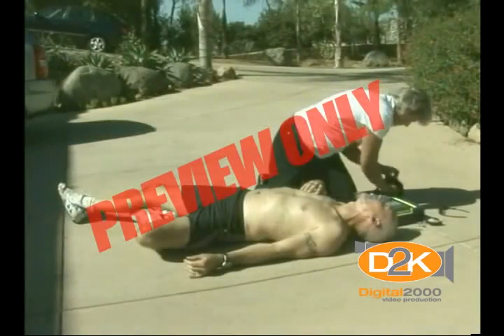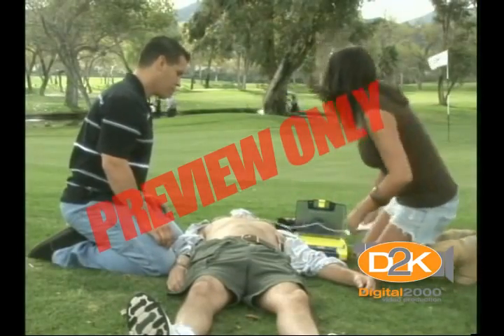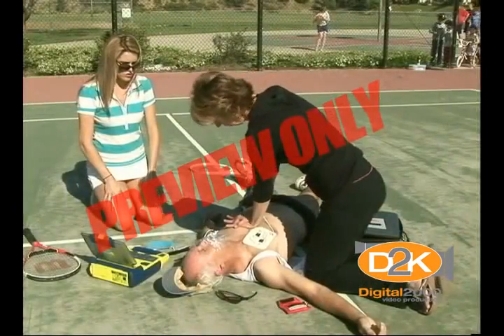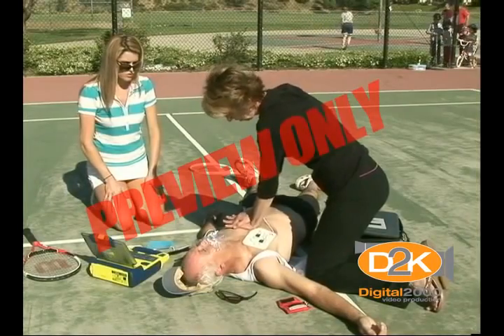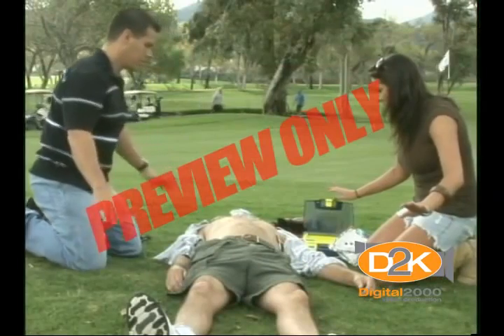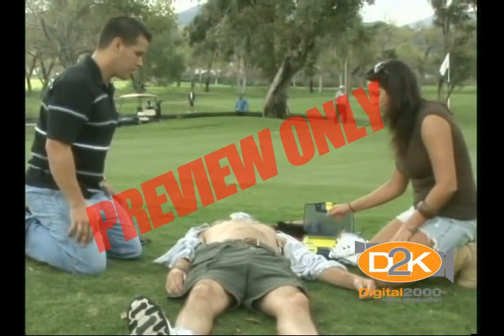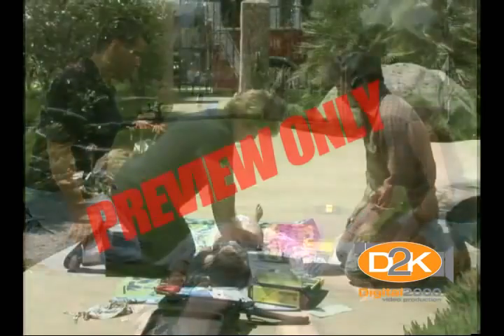There will be a certain percentage of people where no shock is indicated. If the AED indicates no shock, it will tell you to start CPR with chest compressions. The AED will reanalyze every 2 minutes. While the AED is analyzing or shocking, do not touch the patient and do not remove the pads, even if the victim shows signs of life.